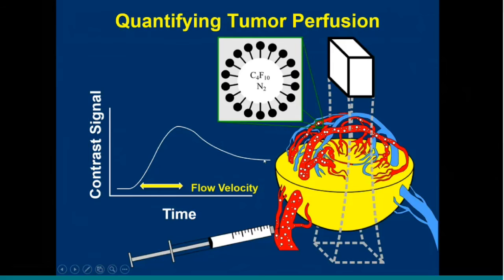If you've done contrast enhanced imaging on mice before, the vascular volume or the blood pool volume of the chicken embryo is comparable to that of a mouse, particularly on the time point that we do our imaging. So the injection volume that you'd want, about 50 microliters per mouse, is about right for the chicken embryo. But a thing to consider is that the amount of tissue between the blood vessels that you're interested in, the ones that are within the tumor volume, and the transducer itself, there really isn't much there. And so the contrast signal is not going to be attenuated through the tissue very much at all. And so you'd be well served in diluting the contrast agent a bit.